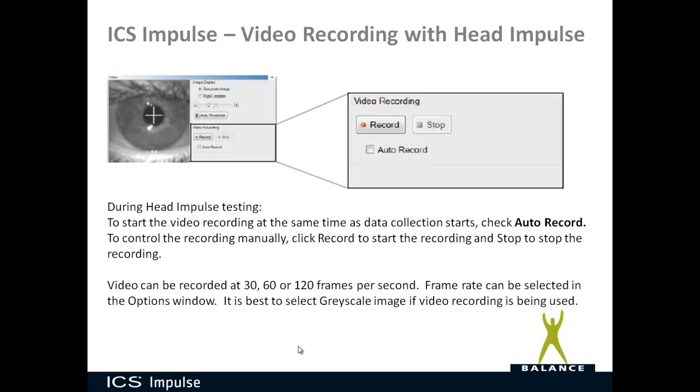Under the options tab, you have three options for what speed you want to video record during head impulse: 30 frames per second, 60 frames per second, or 120 frames per second. It is best to select grayscale image if video recording is being used.